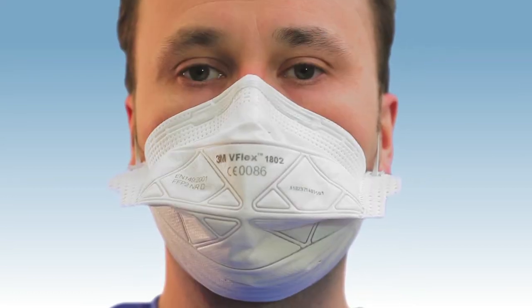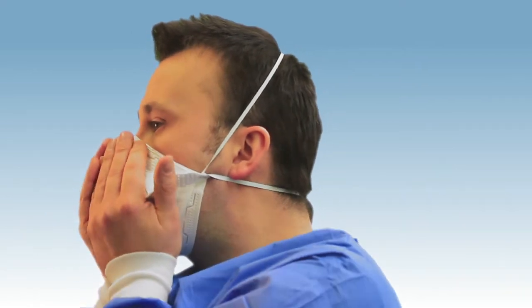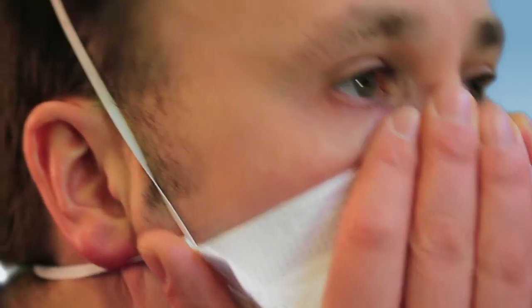Before you start work, always remember to perform a fit check. Cover the front of the respirator with both hands, being careful not to disturb the fit of the respirator, then breathe out sharply.